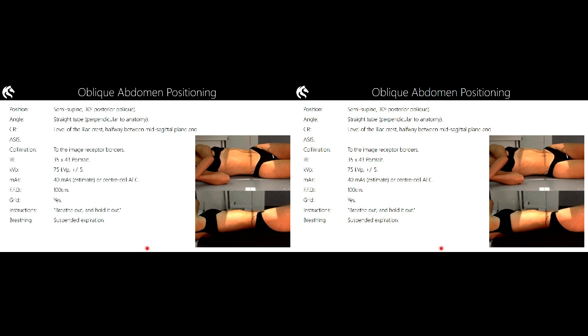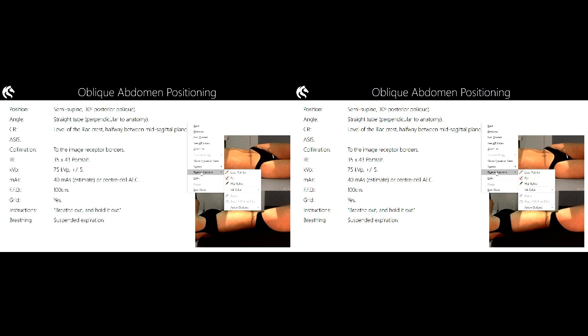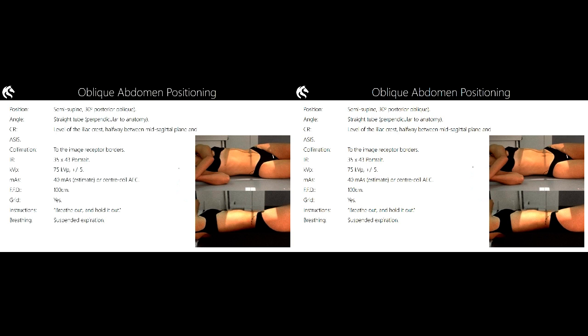Look, what I'm going to do is let's make things a little touch easier for ourselves. Instead, what I'd like you to do is this. Visualise that abdomen from the perspective of the X-ray tube. And from there, to try to imagine the soft tissue borders, or indeed see the soft tissue borders. We'll see if my drawing skills hold out a little touch.